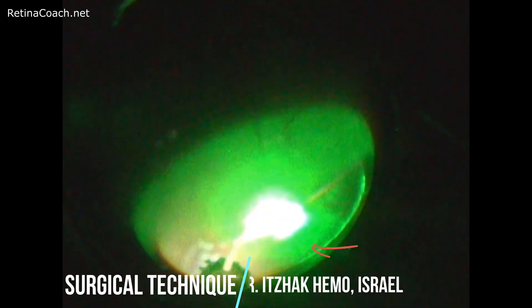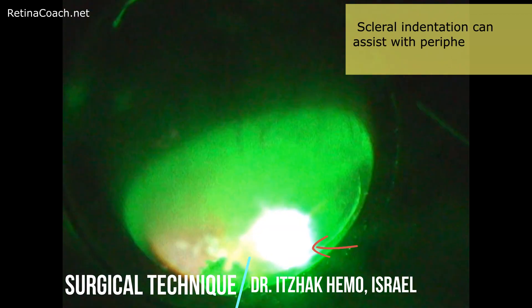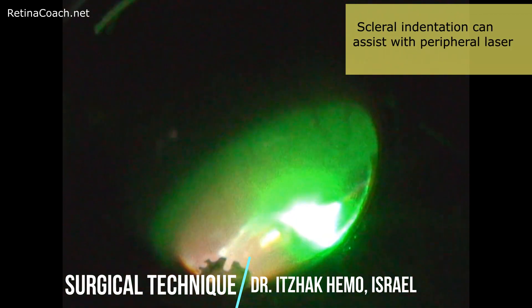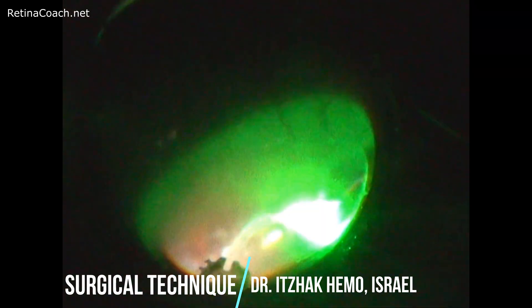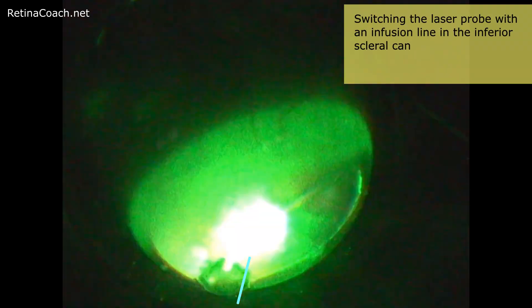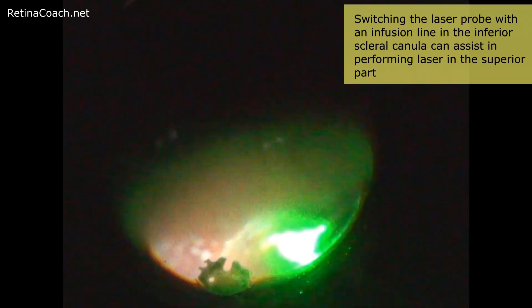Fourth, scleral indentation can assist with peripheral laser. Switching the laser probe with an infusion line in the inferior scleral cannula can assist in performing laser in the superior part of the retina. Several types of laser probes exist.